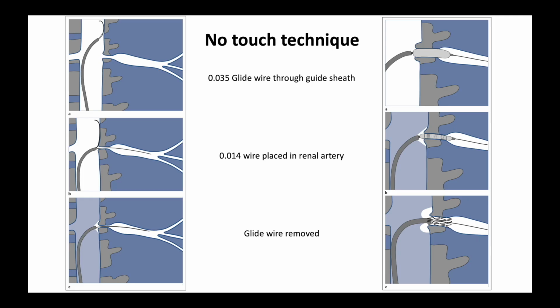The other thing is, you do not stent long all the way into the distal renal artery, because you need to leave the space for vascular surgeons to put their grafts in case they are required. Like we do for Lima graft in the LAD, you do not put your stent in the LAD at a place where the graft insertion has to take place. Similarly, this is what we do here.